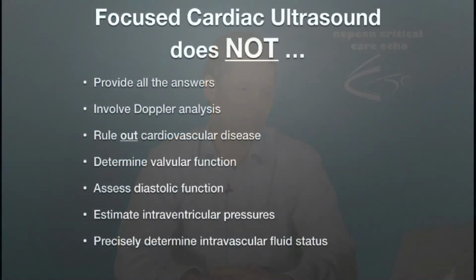Focused cardiac ultrasound does not involve Doppler. For me, Doppler is part of intermediate or advanced training in focused cardiac ultrasound. And I hope to be able to teach you some of that, but it's important to learn to walk before you can run. And the limitations that we're discussing in focused cardiac ultrasound, there are absolutely even more limitations when you're involved with Doppler ultrasound. So again, it's important to know some of the fundamentals before we branch out into Doppler.